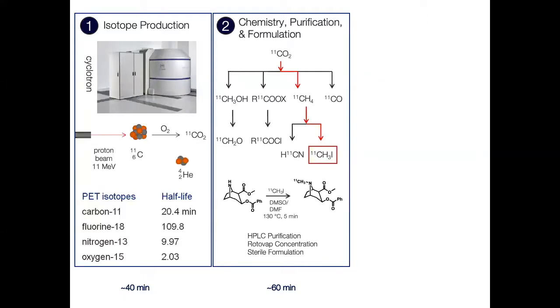And in this case, there are a number of chemical steps involved, and it's really important to do purification and formulation all within a very controlled environment so that everything stays sterile. And you also have to remember that some of the things produced during this process can be automated, but some of them actually need a human to be involved. So they are going to be dealing during this time with radioactivity.